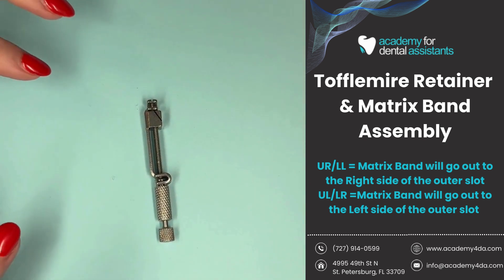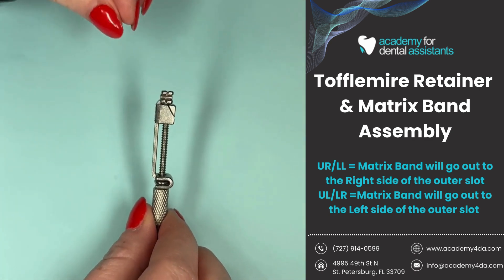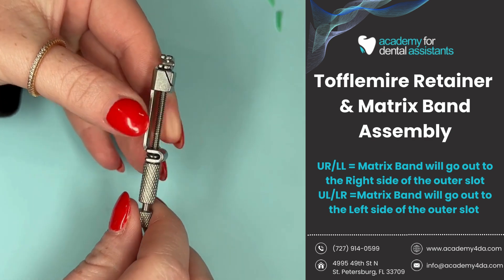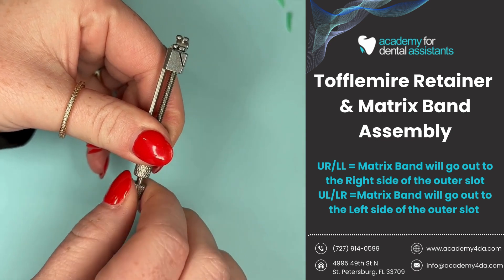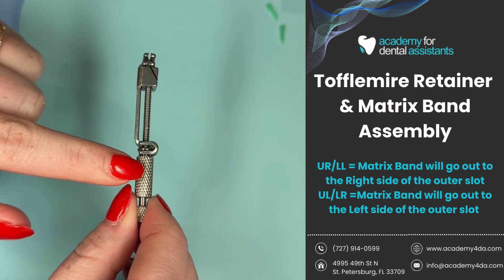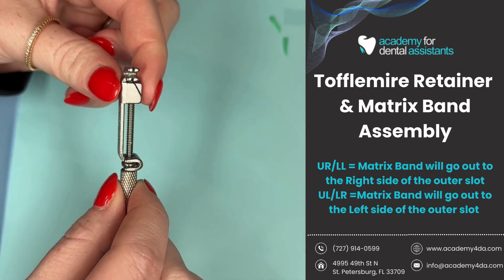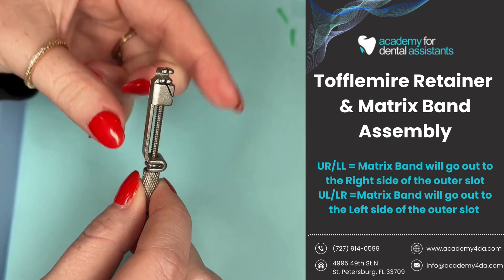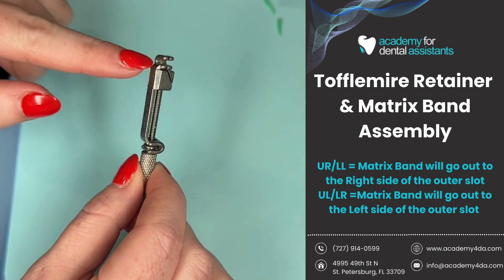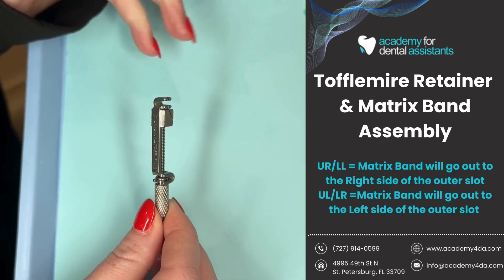This here is our Toffelmyer retainer. It has a few different parts that I'm going to explain. This here is our outer knob — it's going to control and help lock our matrix band into place. This bigger one is our inner knob, which drops this diagonal slot down the spindle to help tighten it around the tooth. This here is our diagonal slot, and this here is our outer slot.